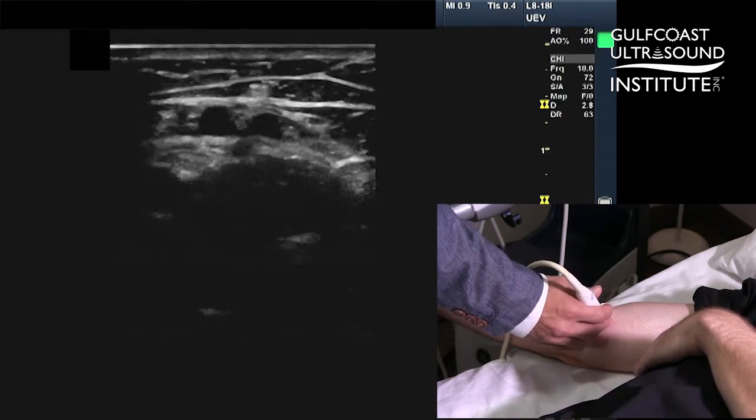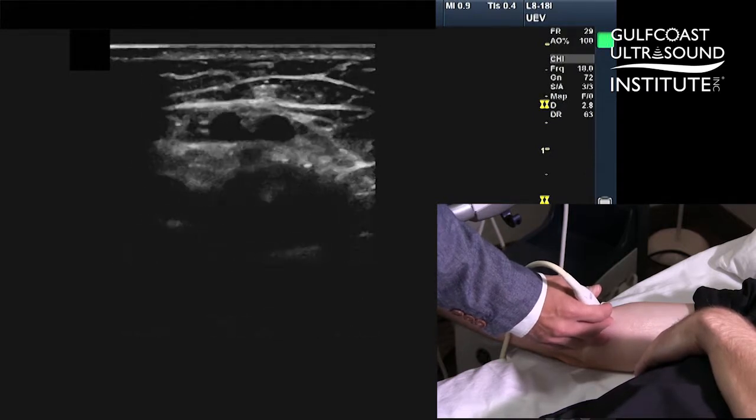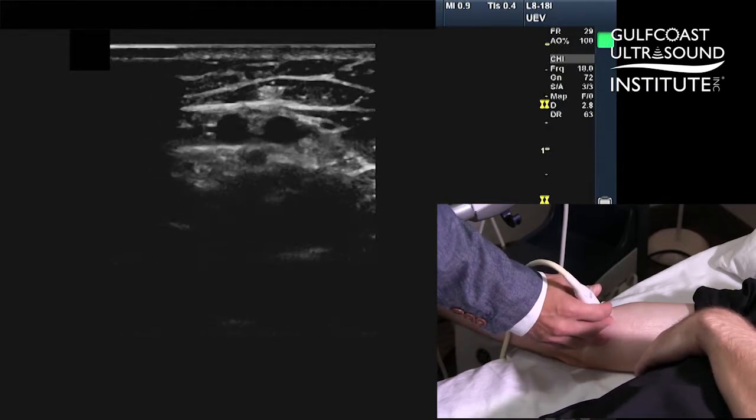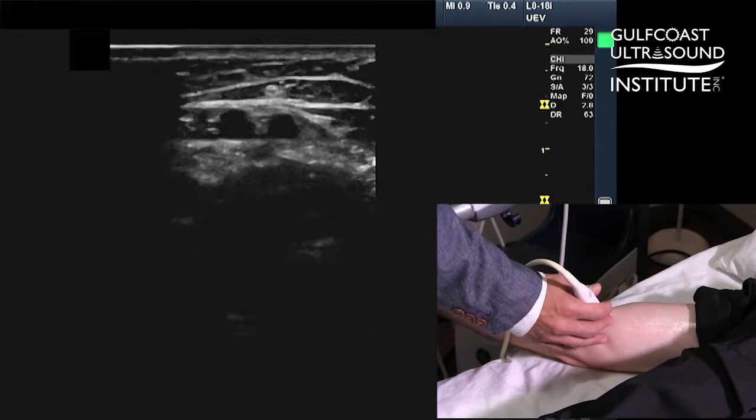So when I see some structures here, and I'm using contrast basically to detect the difference between black and the surrounding gray, I see some candidates here that might be vascular structures.